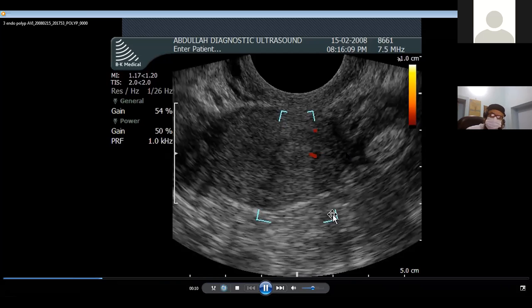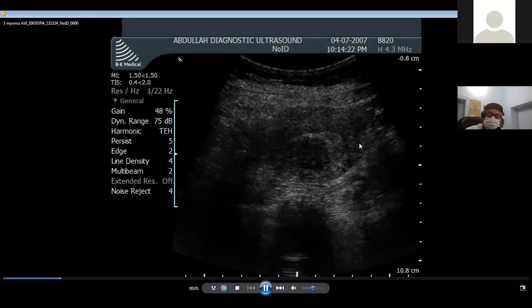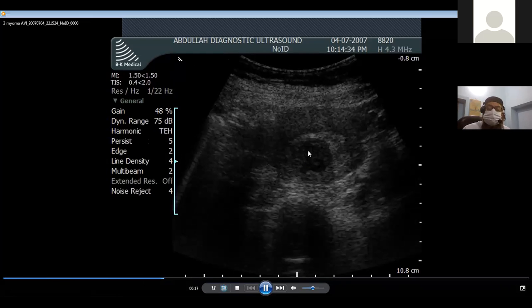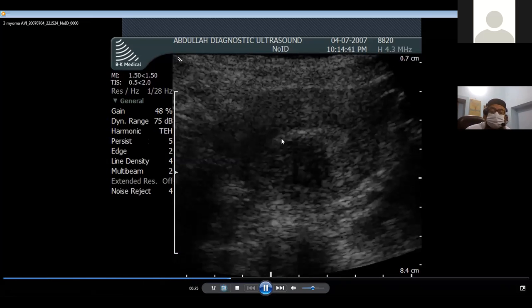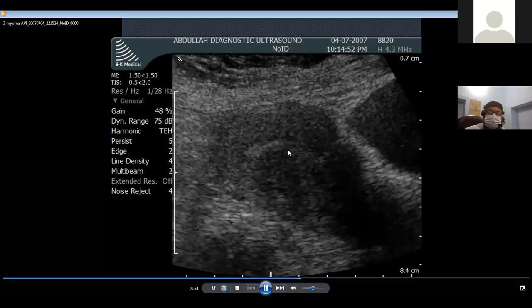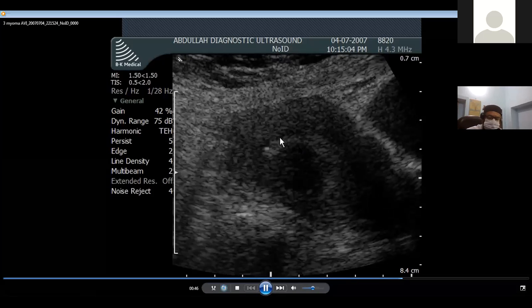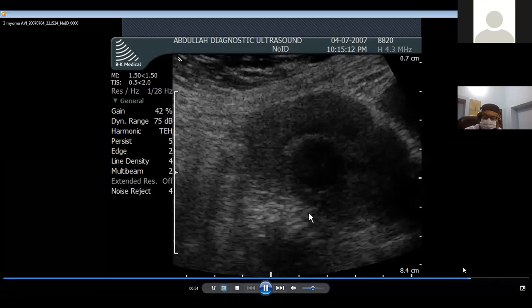If we come across a uterus with endometrium and a myoma which is dark gray, arising from the posterior wall and pushing itself into the lumen. Here you see. You can also appreciate that the endometrium in this segment of the lumen is compressed by the polypoidal myoma. This is how it appears. Well demarcated and dark gray. This is a polypoidal myoma.